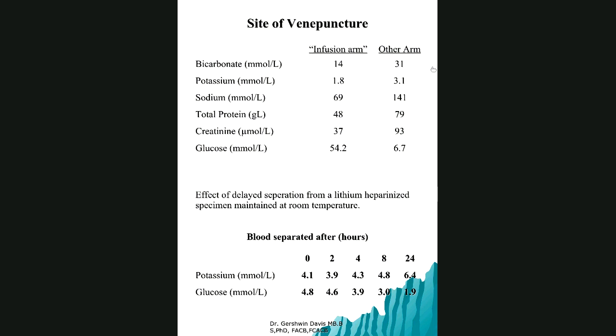All right, so let's do this. Most people are putting it in the chat. That's quite correct. The glucose results are elevated. Maybe they took the sample from the site of the 5% dextrose infusion. Right. So that's one point. This is correct. As you can see here in the infusion arm, 54.2. Okay? So most likely they took it from the side of the infusion arm compared to the other arm.